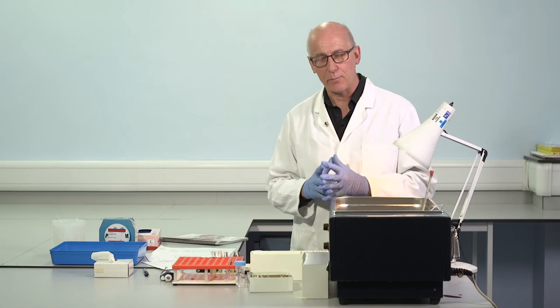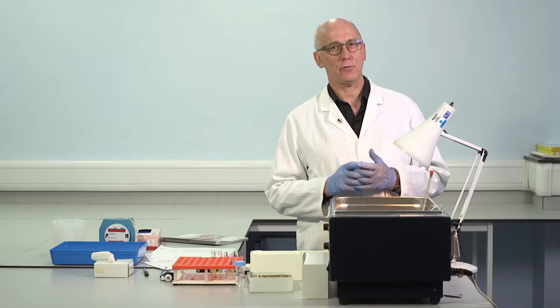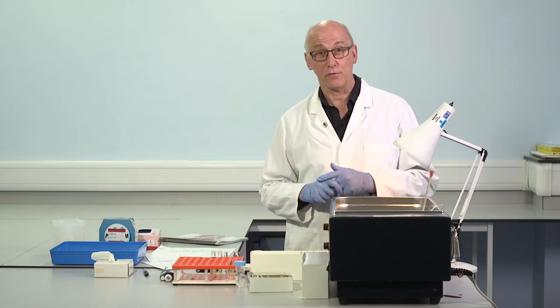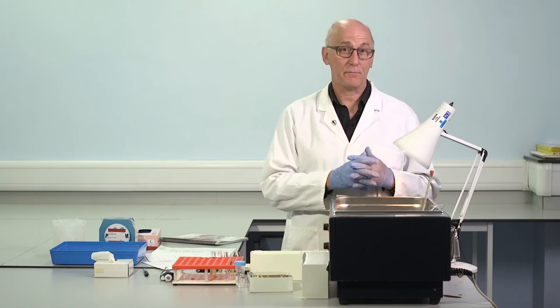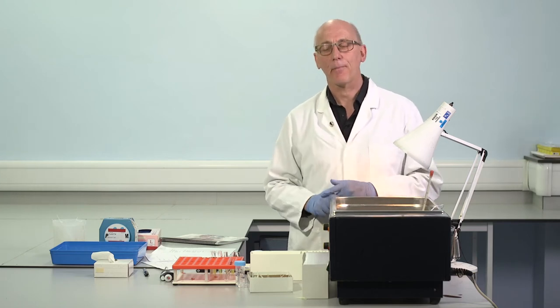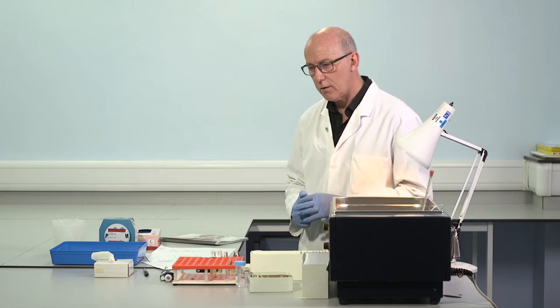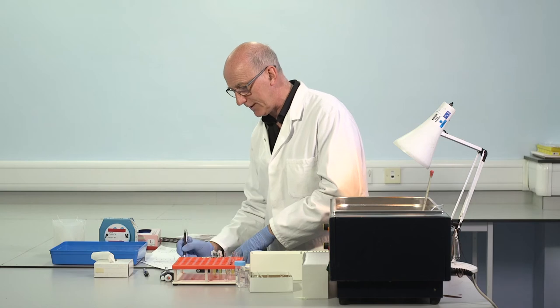Same centrifugation, same processing. Because our APTTs are performed on samples which have not been frozen, but in that interval, 2 to 4 hours after collection usually, that's the same for the normal subjects, not on frozen samples. Processed, let's say fresh, not frozen, in that same time interval. So it's treated in the same way. And when we did that for this particular reagent, the upper limit of the normal range was close to 39 seconds for this particular lot number.